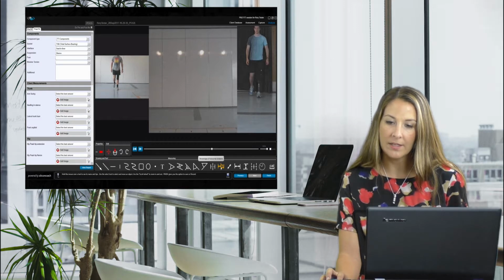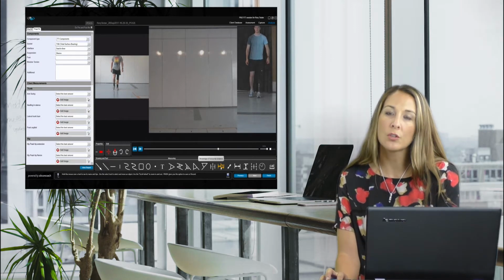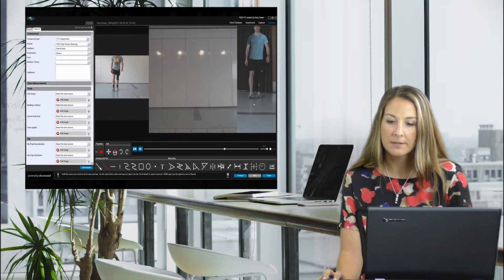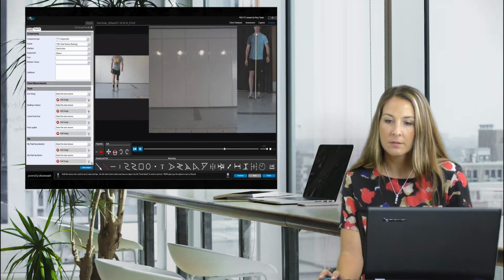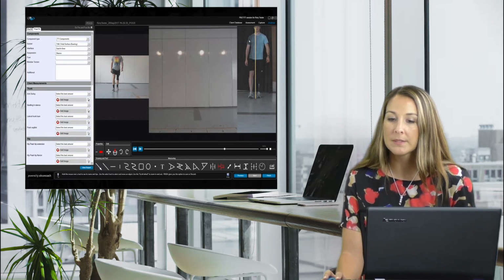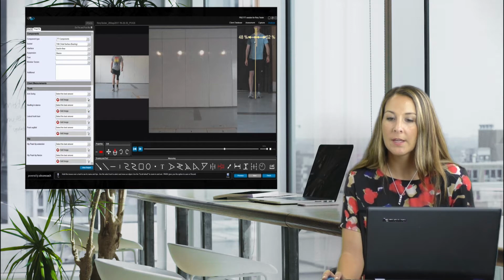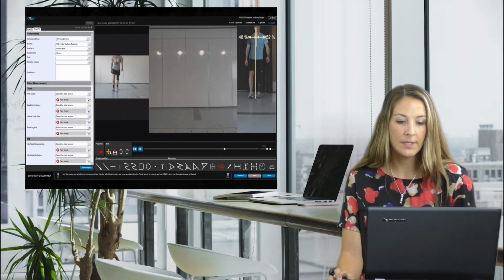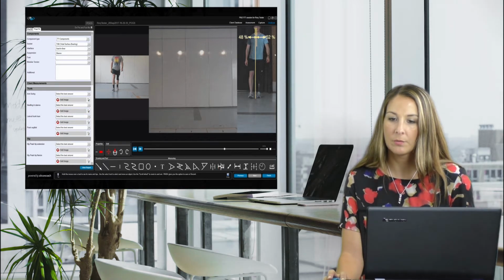And again, we can take a look and see, okay, so let's just do the shoulder, the lateral lean, and see if he's any better. So I'll take my line measurement. I'll go through the center and see, okay, well, maybe he's not that much better, but you know, it's a starting point for a discussion about how he could do some improvements. So we'll go from one shoulder to the other and then go to the center again and just hover there and wait for your tool to catch up to you. And then if it won't, oops, then we'll take an image and we'll put that into our report.